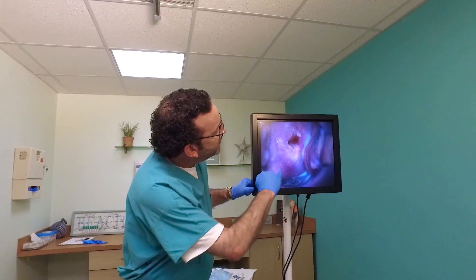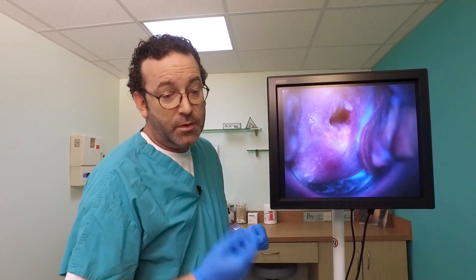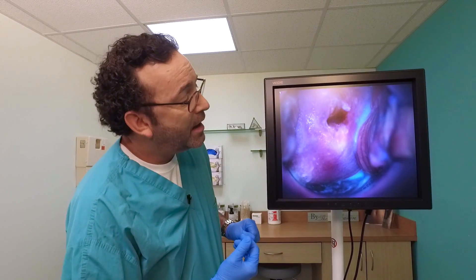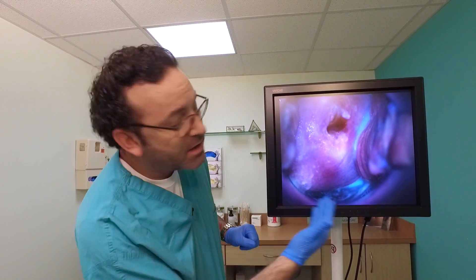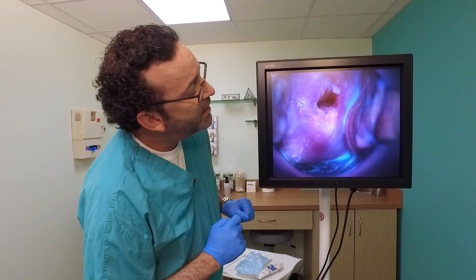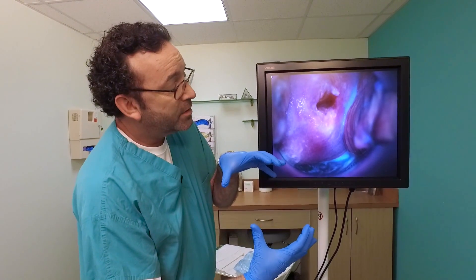Now, when you see your cervix here, this is the opening, and this opening is just a few millimeters big. Everything is very magnified here on the colposcope in this high-resolution image. This little few-millimeter opening dilates up to 10 centimeters — and that's where the baby comes out.